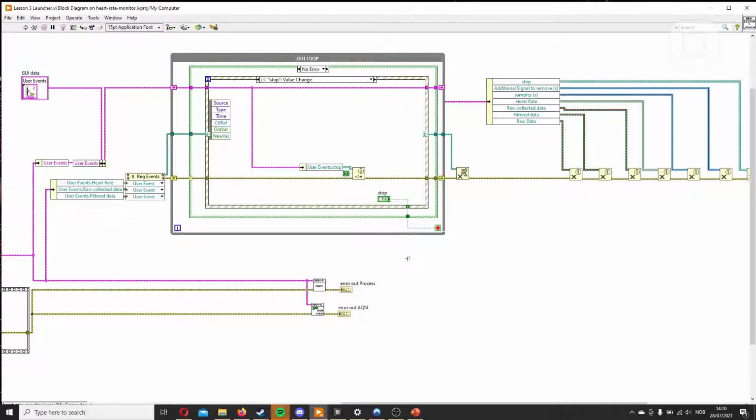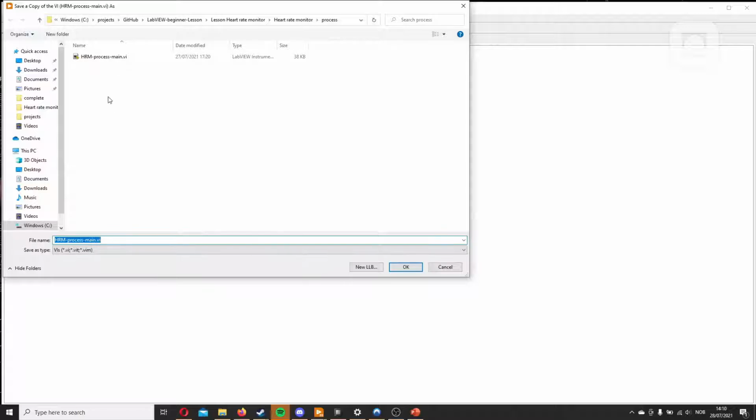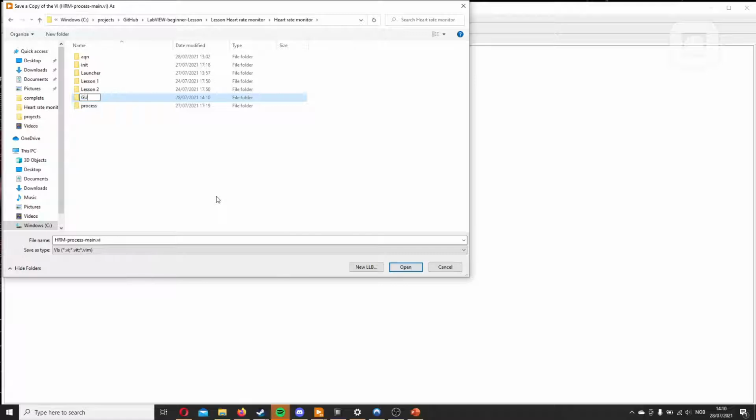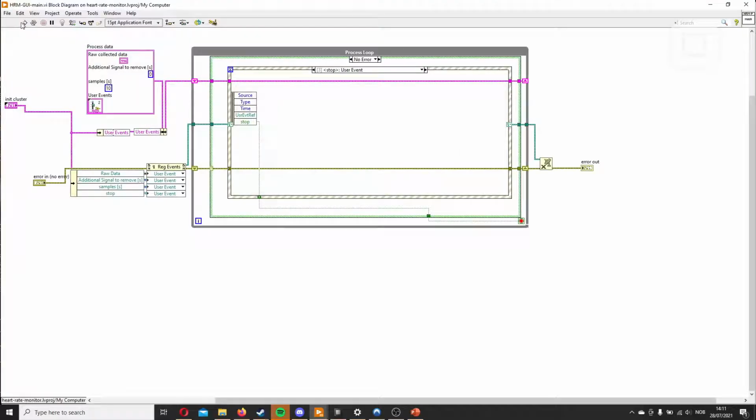So what we'll do instead is save as, and we'll copy this one, just like we did with the other ones. And we will put this in its own folder, GUI. And we'll also change the name. We want to keep the input and the output since that will be identical, but we'll delete all the content here.